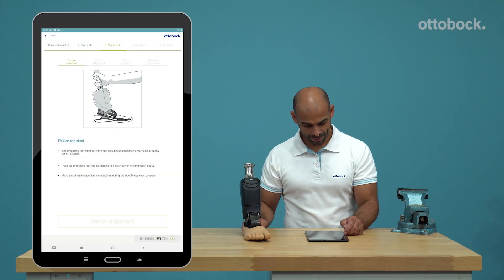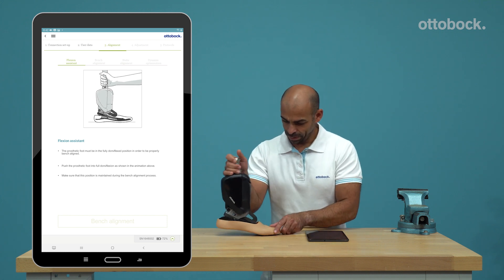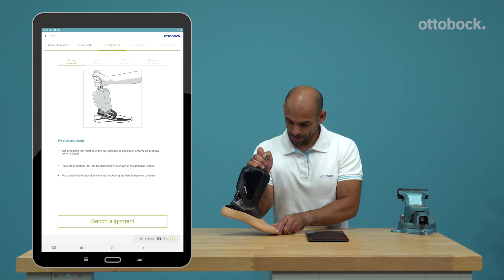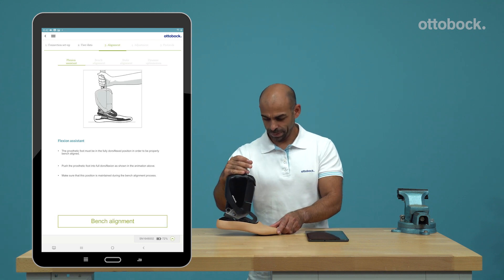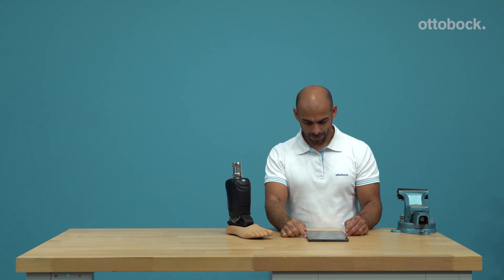For a proper bench alignment, the prosthetic foot has to be in the fully dorsiflexed position. The app confirms through an audio signal when the desired position is reached. It is important that the foot maintains this position for the whole bench alignment process.